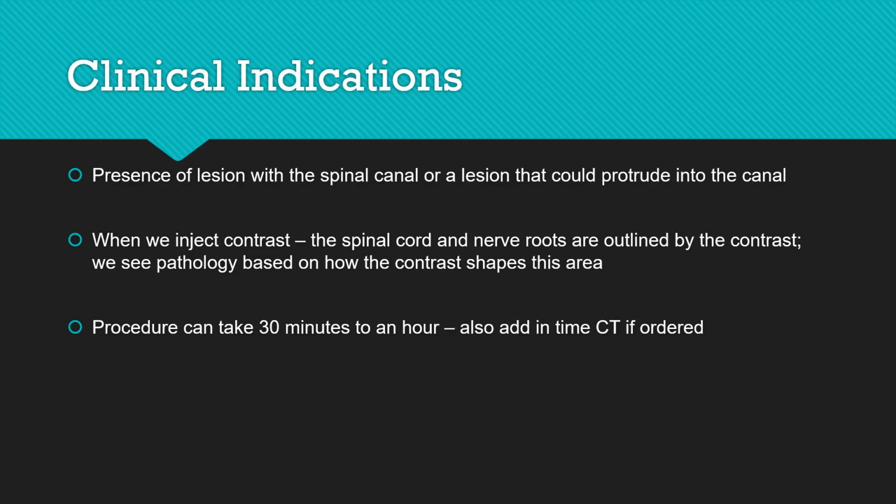Procedures can take 30 minutes to an hour. You also need to add time in for CTs if they're ordered. So the myelogram will only take 30 minutes, but then the CT may take an additional 30 minutes. So just make sure you let the patient know.